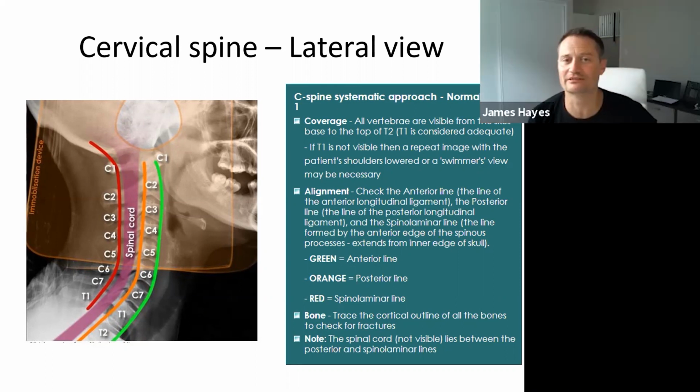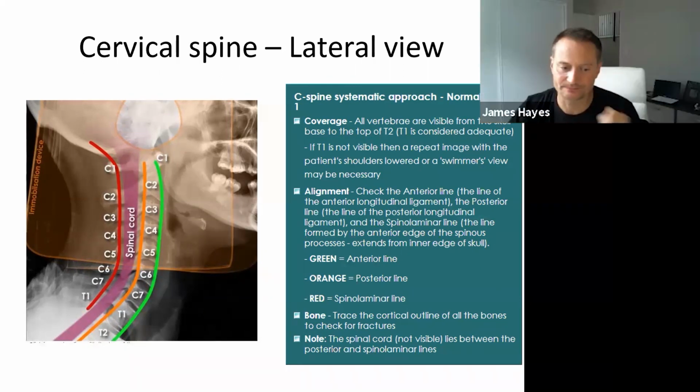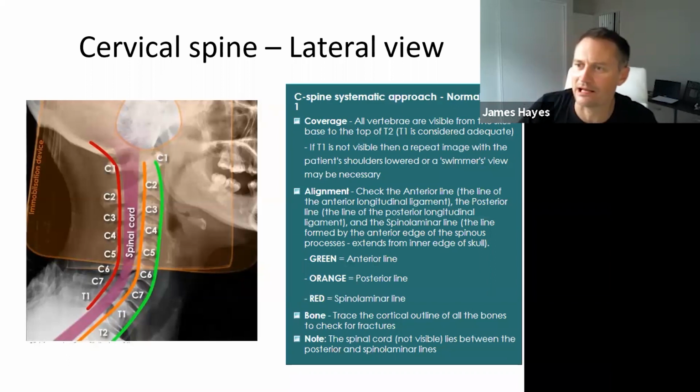No, that's a really good question. Thank you. So, rheumatoid arthritis and lateral ankle. And then Carly's asking if you have any hints for picking shoulder dislocation. Yes. If someone asks you, always say it's an anterior shoulder dislocation, because then you'll look like you know what you're talking about, because about 90% of them are anterior.